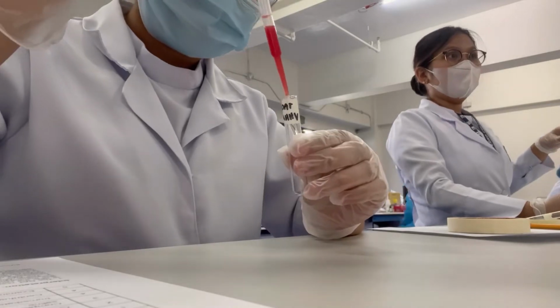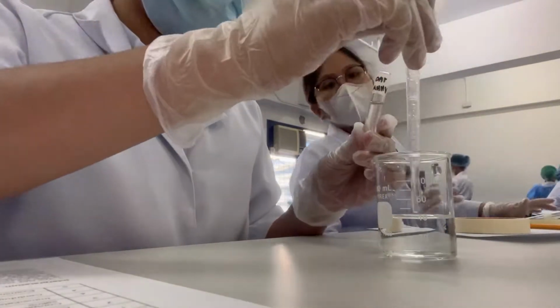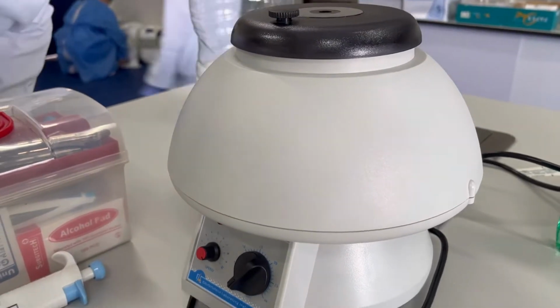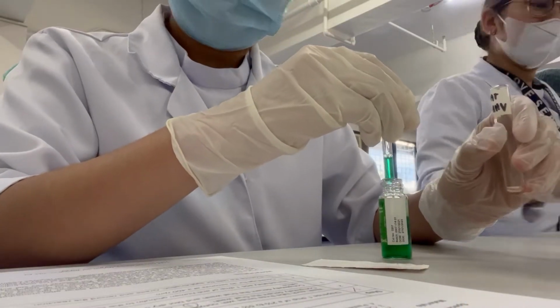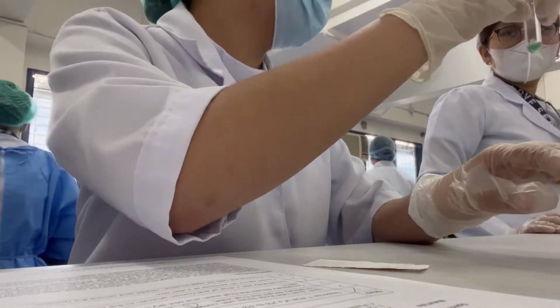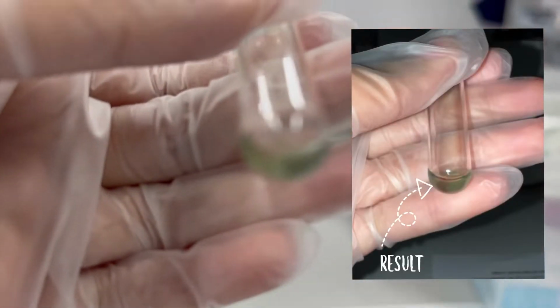Dispense 1 drop of red cell suspension. Then wash each tube 3 times with normal saline solution. Then decant. Immediately add 1 drop of anti-human globulin to the cell suspension. Then centrifuge for 30 seconds at 3,400 rpm. Lastly, examine the cells for agglutination.